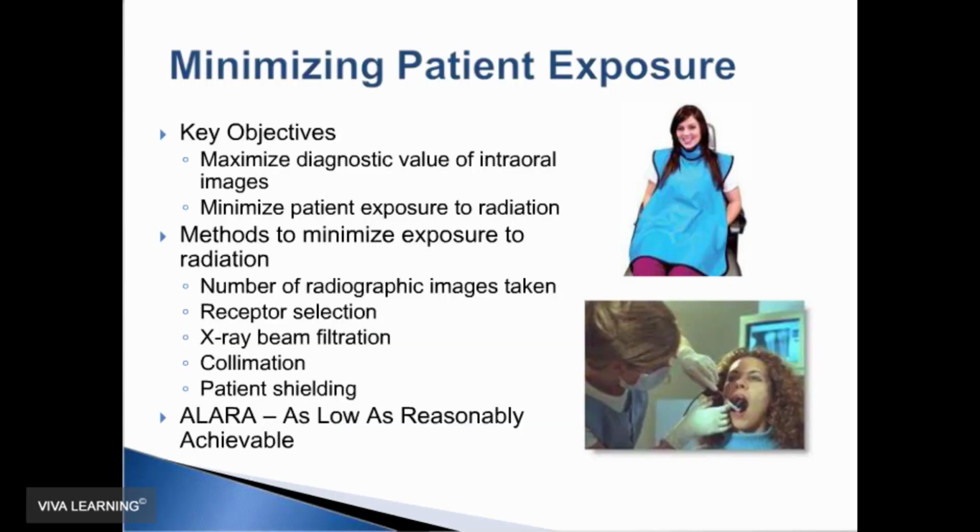Ways to minimize exposure. Our key objective is to maximize the diagnostic value. So typically, once the survey is prescribed by the dentist, that survey is then delegated to staff, typically hygienists and assistants, who will be taking the radiographic images.